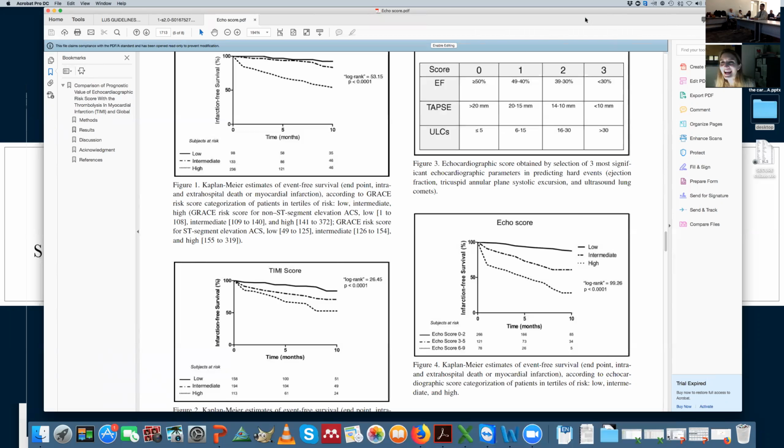Okay, Luna. I think the lung ultrasound can be very useful for the cardiologists, because they see patients as ambulatory or inpatient, outpatients, and they can stratify the risk for the future. You know, you have written a lot on this topic.